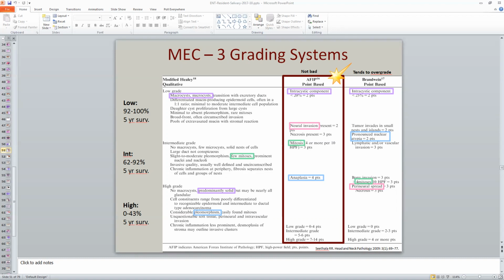And then Nicole, just if I can chime in. Yeah. What you as radiologists need to remember is, just like she's going through all these grading systems histologically, we need to radiologically guide some kind of management. When you have low grade mucoepidermoids, they're going to look like low grade tumors, or they're going to be well differentiated. Because they have a high proportion of the mucinous cells, there's going to be prominent cyst formation on imaging.